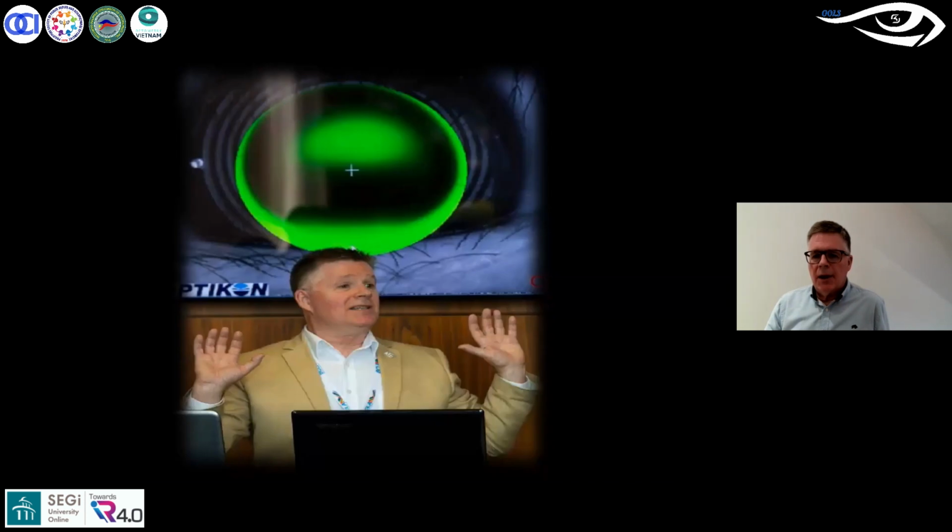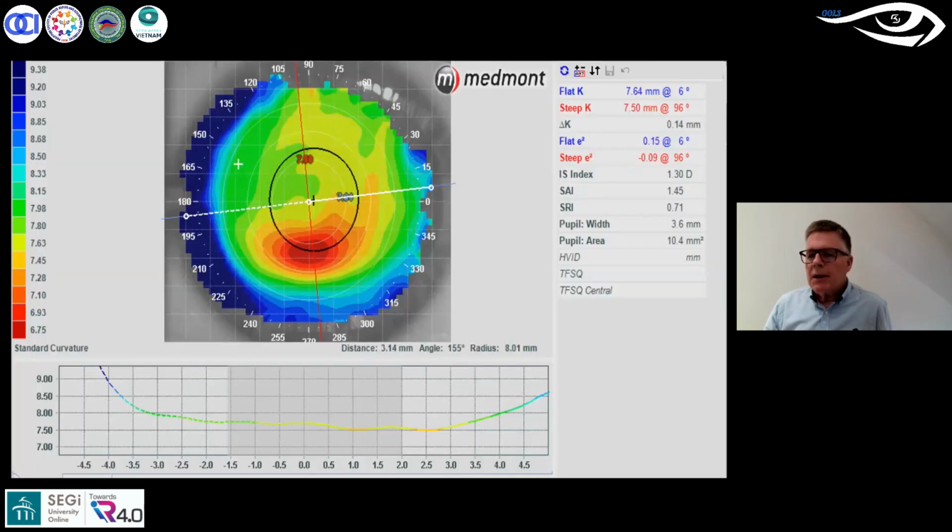And I think the next slide is me at one of the conferences, and that's my posture, which says, I surrender. I say this cannot be done. We need to have more information here, and we almost certainly need to use a scleral contact lens in this instance. So how do we fit scleral lenses from these very basic corneal topographies?